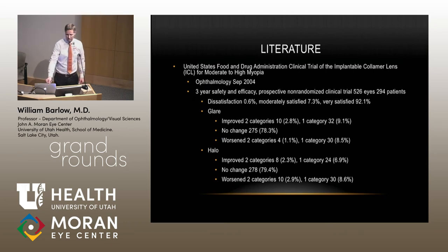It can be kind of a confusing geometry of what's actually happening, because in his case, on his right eye in particular, those PIs are tiny. They're covered by the limbal vasculature. So there's light being reflected from the inside of the eye and out through the PI. Right.